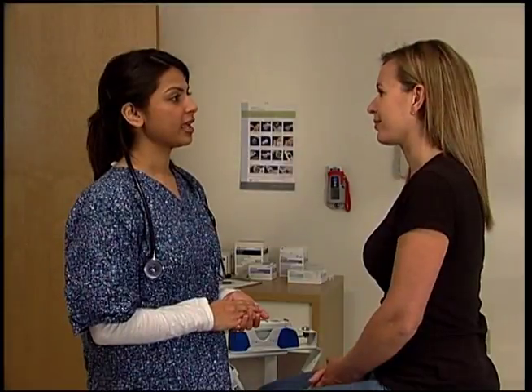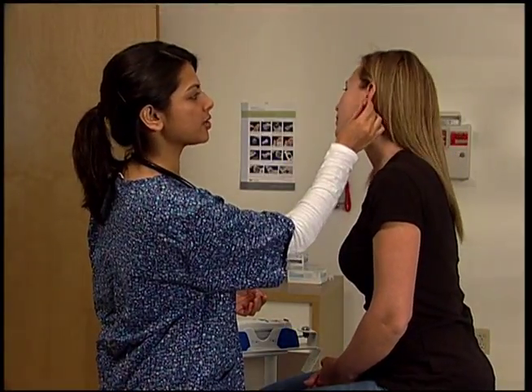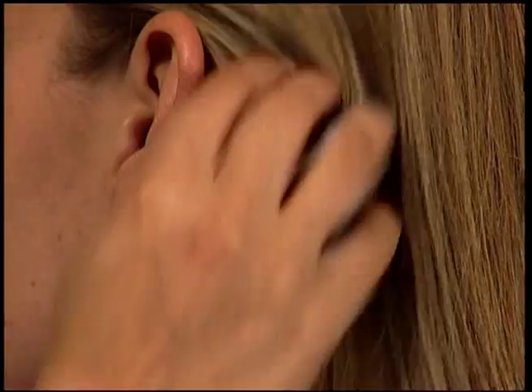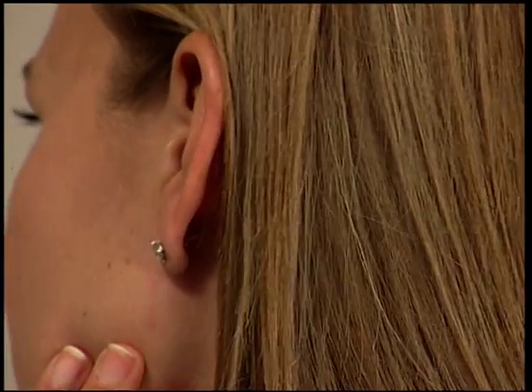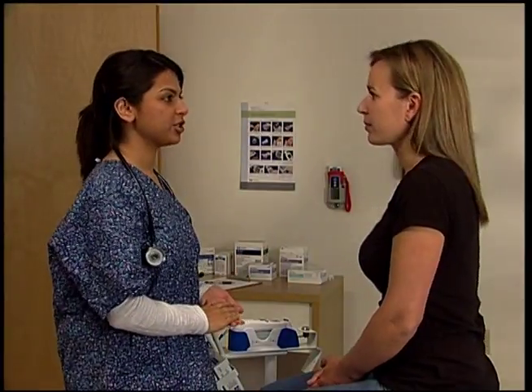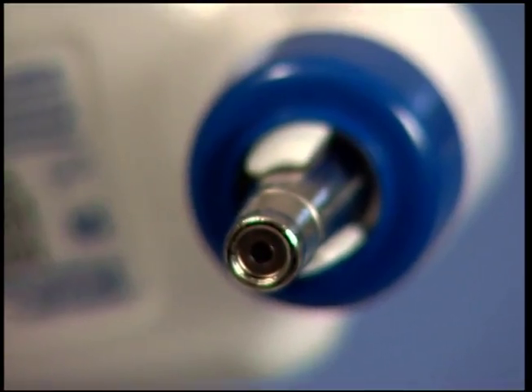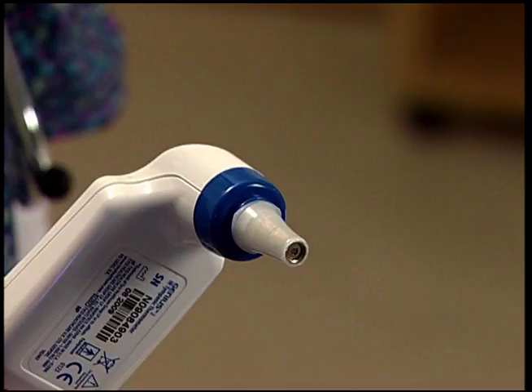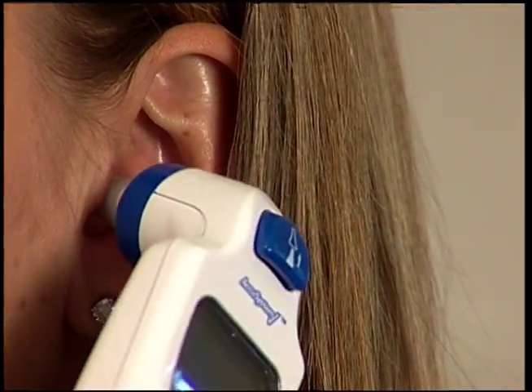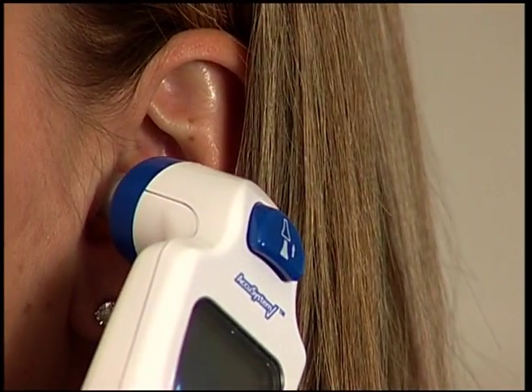To review: visually inspect each patient's ear before taking a temperature. Make sure the ear canal is dry and free of impacted earwax. Never use the probe in the presence of blood, water, or any other liquid in the ear canal. Visually inspect the probe lens to ensure it is clean and free of cracks. Ensure the probe cover is fully seated with no silver showing between the probe cover and the blue end cap on the thermometer. Make sure you get a comfortable seal around the probe tip and ear canal, positioning the tip with the angle of the ear canal to get the most accurate reading.